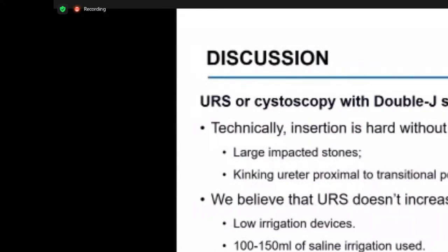When the scope is distal to the transitional point, intrarenal pressure would not increase significantly. And when that happens, we increase the force of irrigation gradually to see clearly until passing the point. And when we pass the point, we also keep the pressure low enough to move the scope upward into the renal pelvis. Also, the result showed neither exacerbation of infection nor death, indicating the procedure is effective and safe.